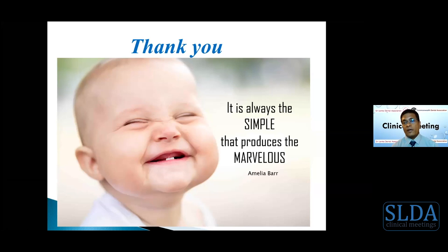And if, by any chance, you have cemented the crown and you see gross occlusal adjustments are to be done, again, there's no choice. You have to cut it out and remake a new one. If you find that you can do fine adjustments and bring it up to the occlusal scheme, then you can check the opposing tooth. If it has enough thickness of enamel, you can grind it and get the occlusion back to normal. Otherwise, you can trim and grind the zirconia crown or restoration, but make sure you do a good polishing before you send the patient off. That is how we should manage that case.